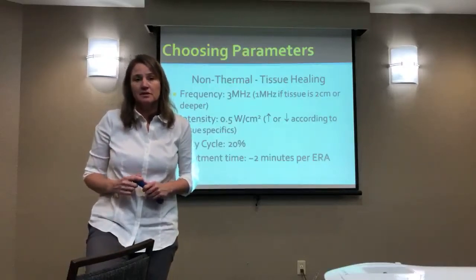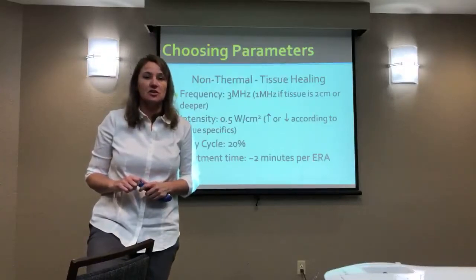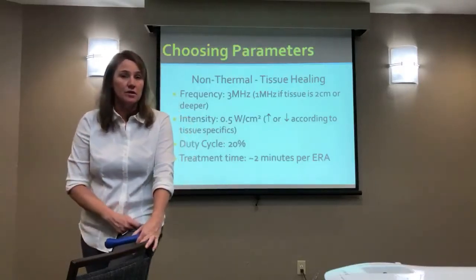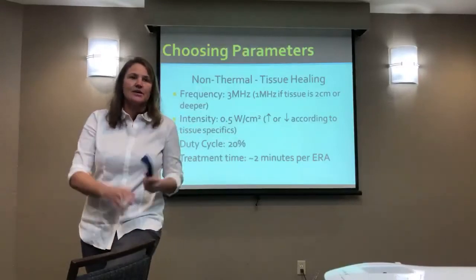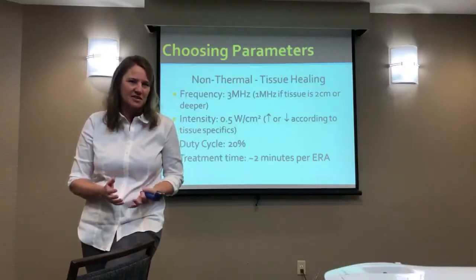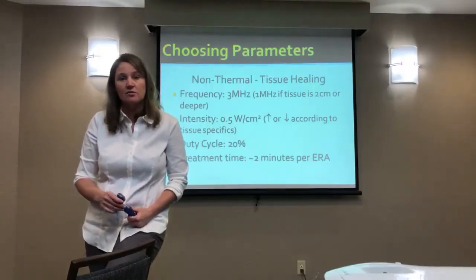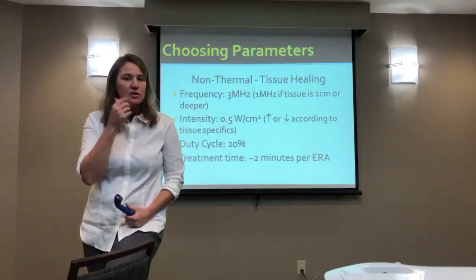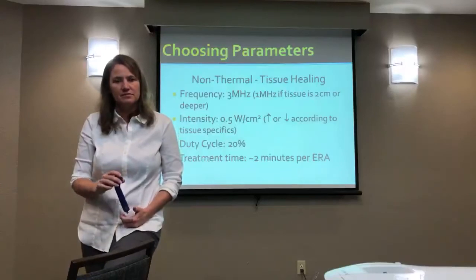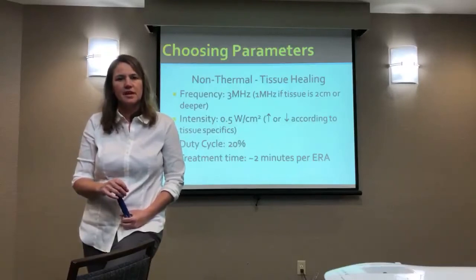Right. So you're actually doing a treatment, and maybe 0.5 is better, but your portable machine just doesn't do it. Yours does 1.0, which would be higher. At least you know you've got enough. Arguably, you'd rather have enough, because if it's very, very low level, the question would be, can it even penetrate the skin? Would it be beneficial? Would it do anything? That's a challenge. I've looked at some of the portable devices, and I think many of them are calibrated so low. I think they're all calibrated at the same level and they're not able to be changed, except the one that you showed me, which has the panel on it.